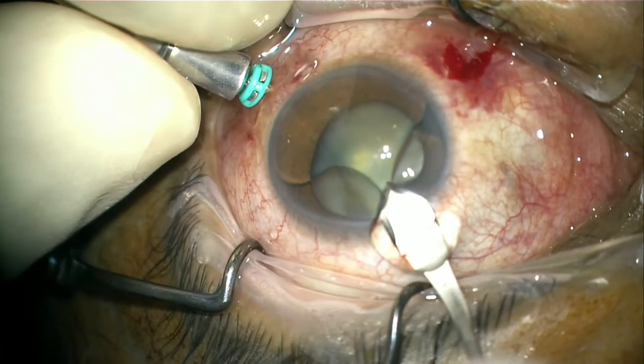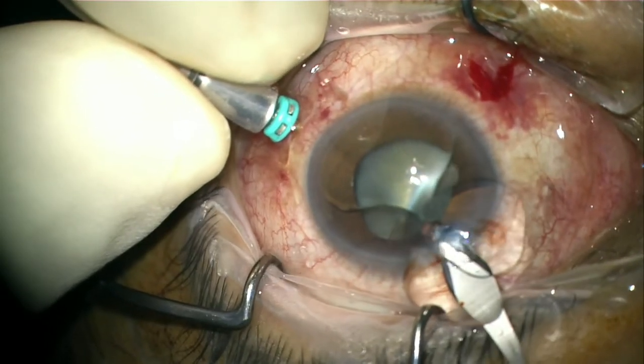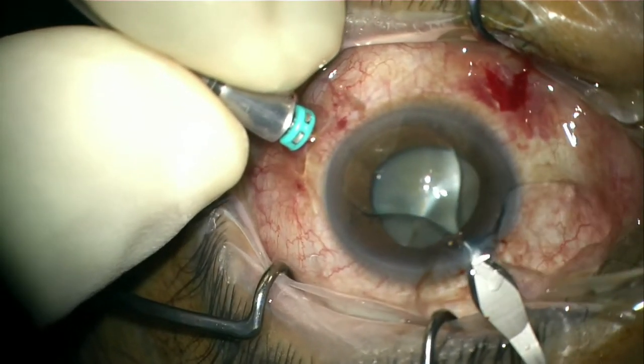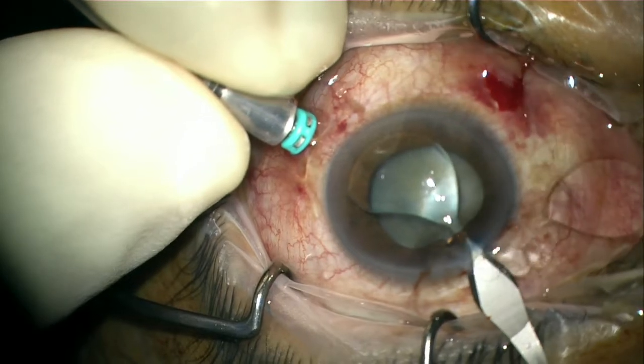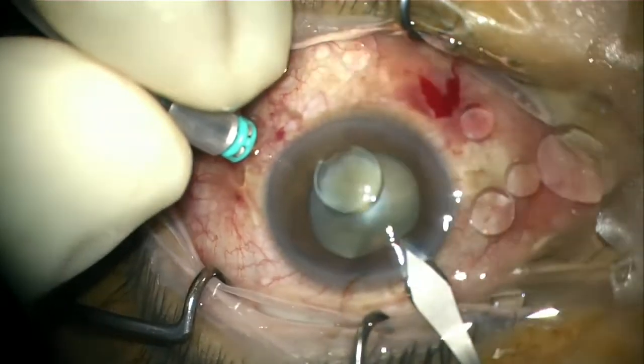Once the infusion is in place, removal of the heavy oil from the anterior chamber was done with ease. The eyeball is rotated superiorly to place the wound relatively inferior. This step is important to allow passive removal of the heavy oil without the need to actively aspirate.